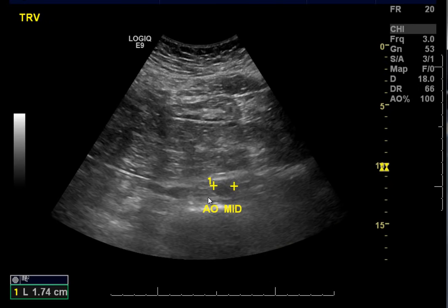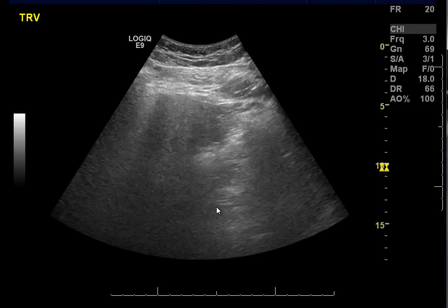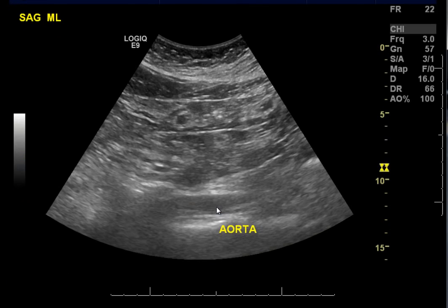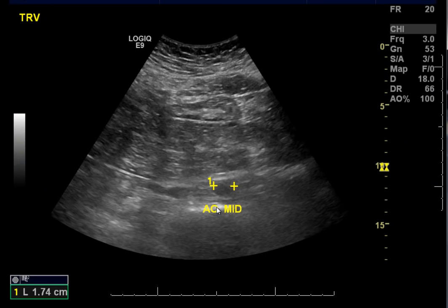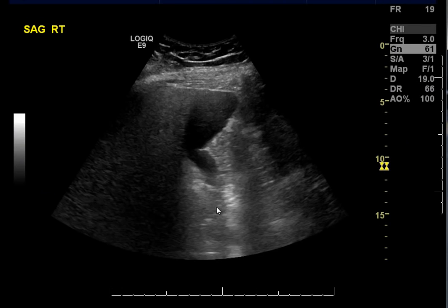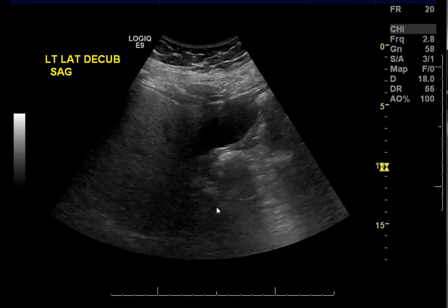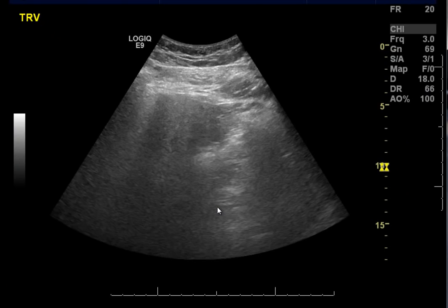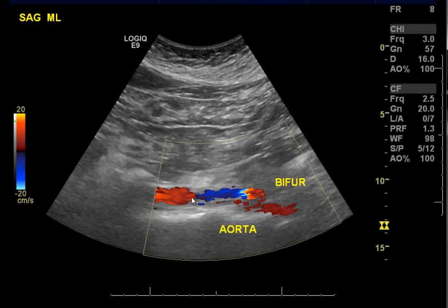And here they're measuring the aorta on the transverse plane. And the reason this has become important is because we all want to recognize an abdominal aortic aneurysm before the patient has a catastrophic event and comes in with a ruptured aortic aneurysm. So there is a Welcome to Medicare program. When males turn 65, they get a free abdominal aortic ultrasound looking for aneurysms because aneurysms are not usually symptomatic.